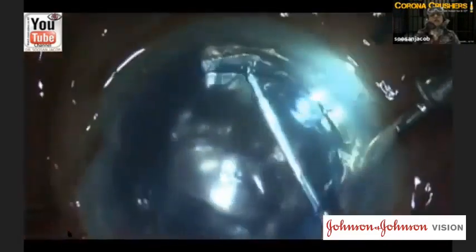And here you can see what I'm doing. I'm pulling that graft, pulling that host Descemet's membrane from above the graft to a position that's below the graft. So I'm actually teasing it up, and this can be done only with the air pump going on because you need a well-formed anterior chamber.